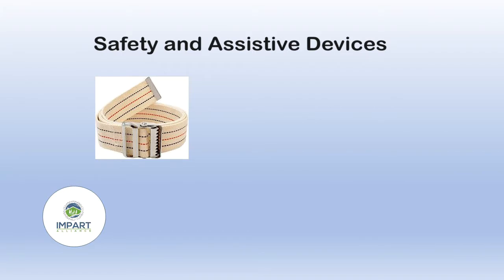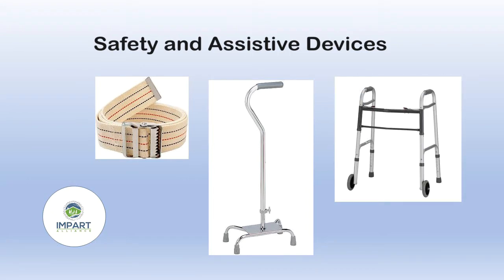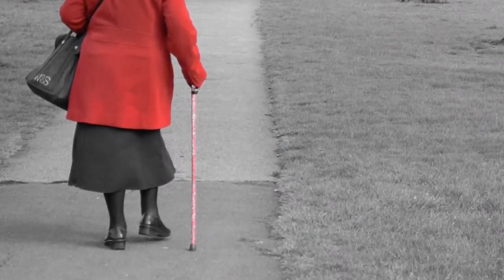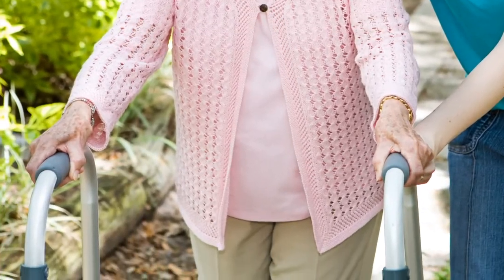There are a variety of assistive devices to help participants walk and do ADLs more safely and easily. Members of the participant's healthcare team will identify the type of device needed, and physical therapists usually determine the right size of device and teach the participant about proper use.